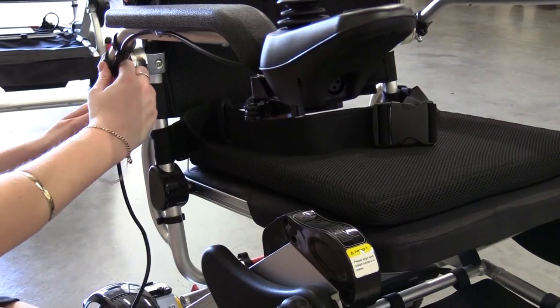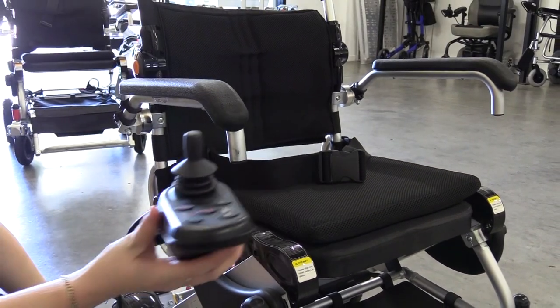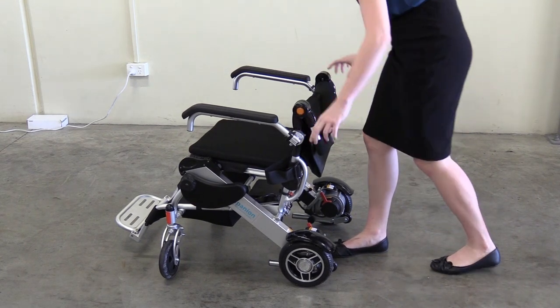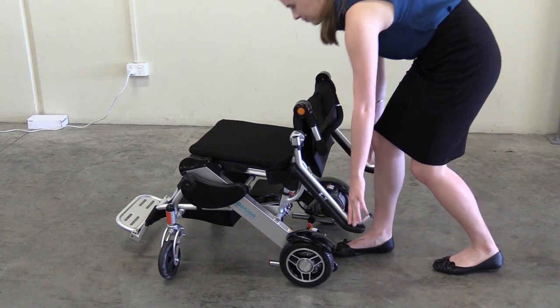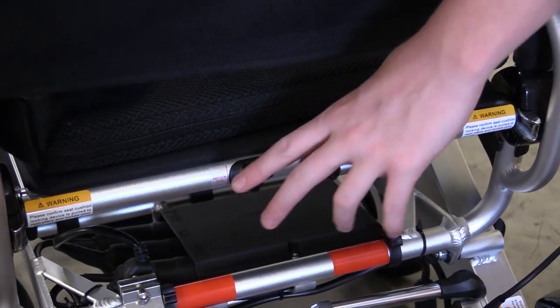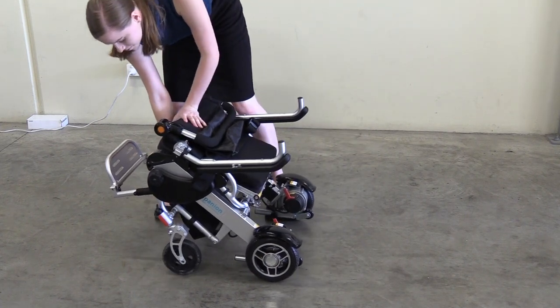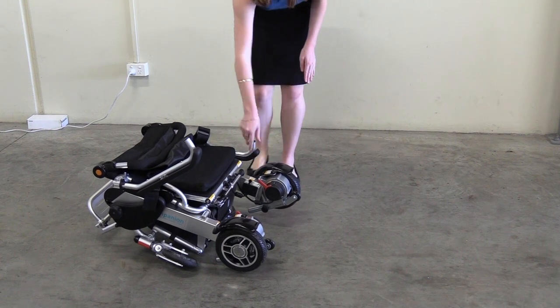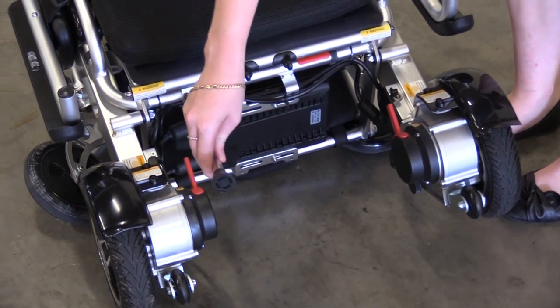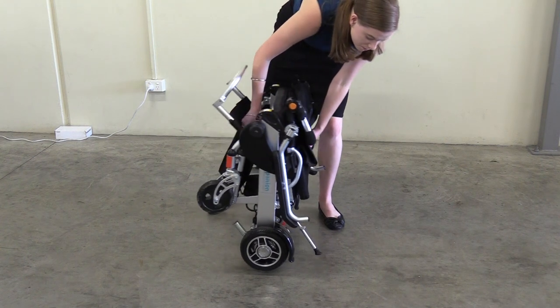Before folding your wheelchair, we recommend unplugging and detaching the control panel to avoid the cable getting caught or damaged. To fold your wheelchair, fold the backrest down. Move the armrest up and behind the wheelchair as shown. Locate the folding release lever at the back of your wheelchair and pull it together to release the backrest. Pull the seat up towards the backrest to fold, then lay the wheelchair on the ground and pull the armrest back towards the wheels. To stand your wheelchair up, pull the support arm located at the back and carefully pull your wheelchair back until it is resting securely.